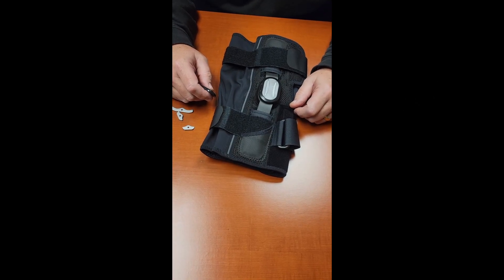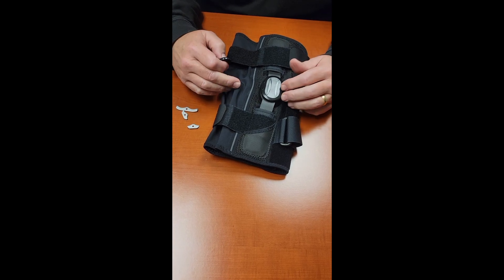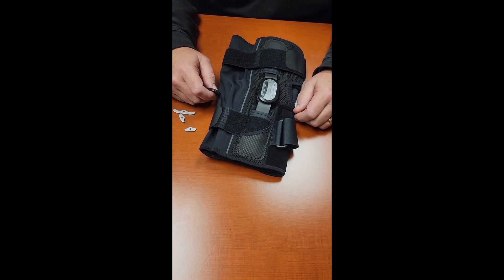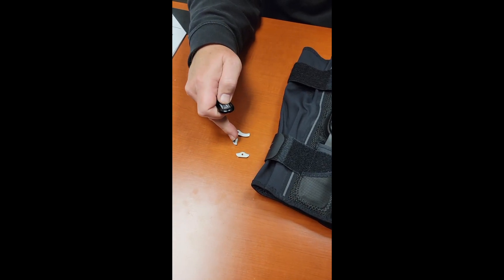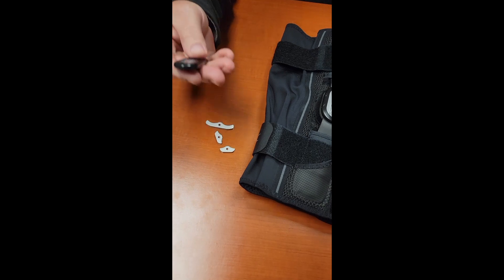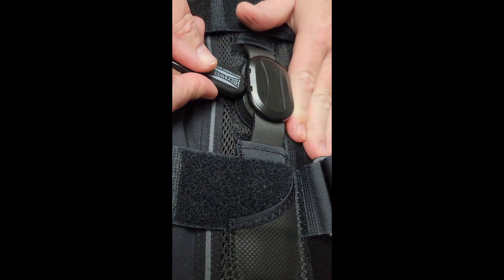We've recently received a few requests on how to adjust the pop stop hinge found in all of our range of motion braces. This is a very simple proposition and all you need are the extension and flexion stops and the tool. Take your tool and simply place it between the hinge and the plastic cap on the posterior side of the brace.